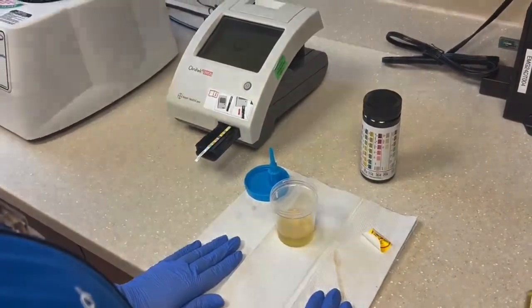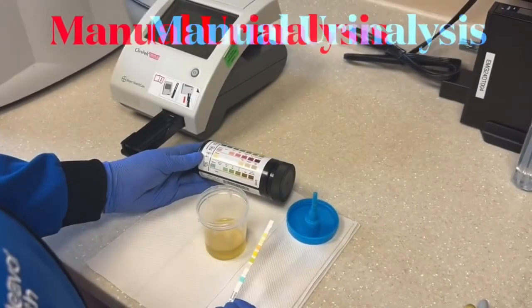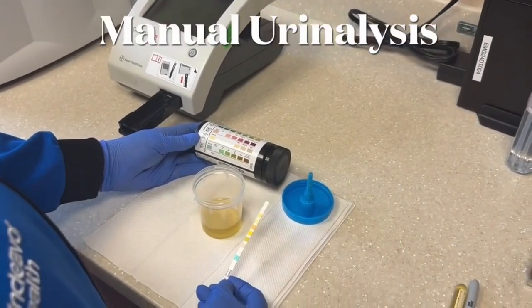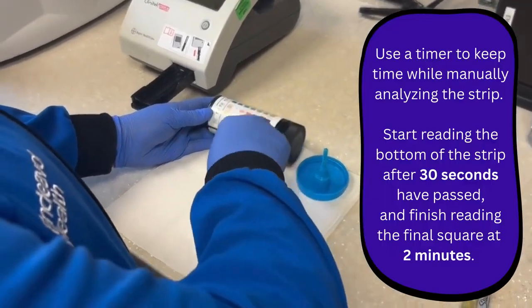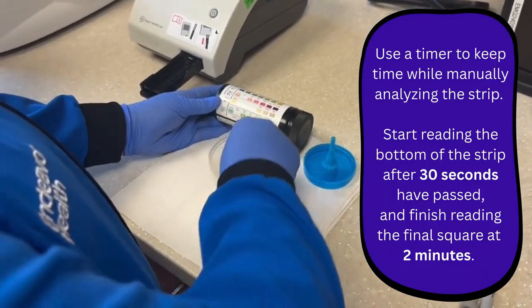We'll await the results. If doing a manual urinalysis, we'll follow all the same steps as before, but this time after dipping the urine strip we'll hold it in a horizontal position to prevent possible mixing of chemicals.